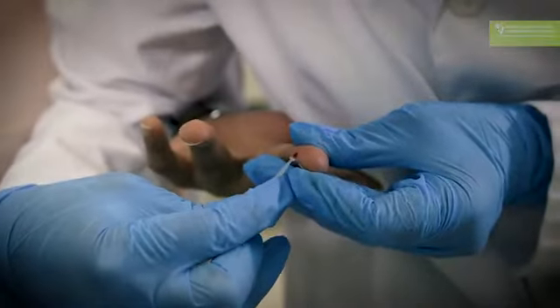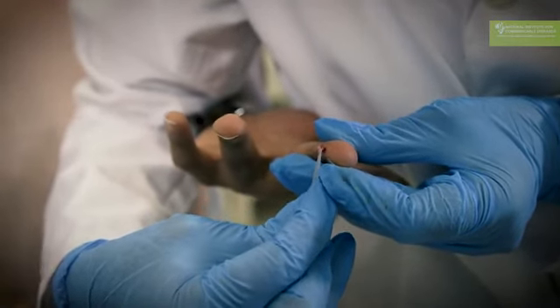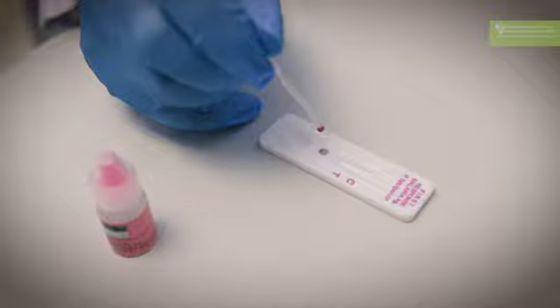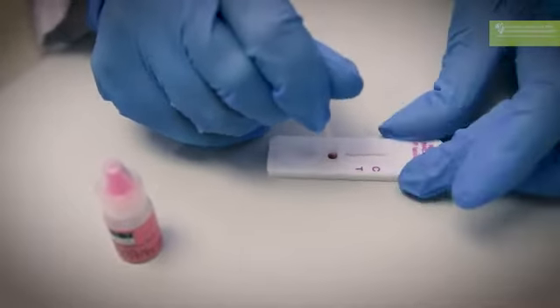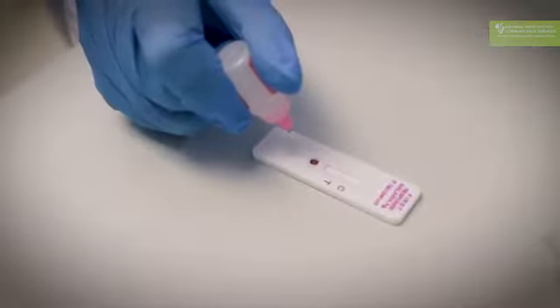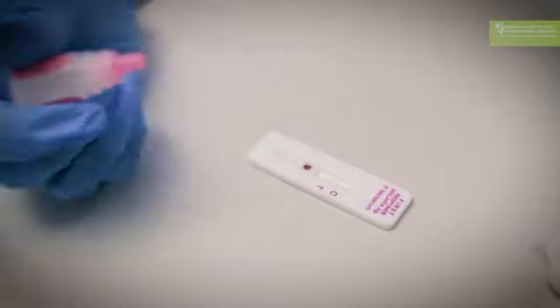You collect. The pipette has a cup which ensures you collect enough blood. So you take the blood and you put it into the blood window of the RDT, and that's all the blood that you require. And you just add 2 drops of buffer into the buffer window. Do not squeeze this like a ketchup bottle. It's very gentle, so you get 2 small drops that come out.